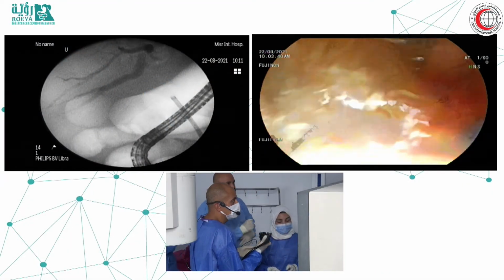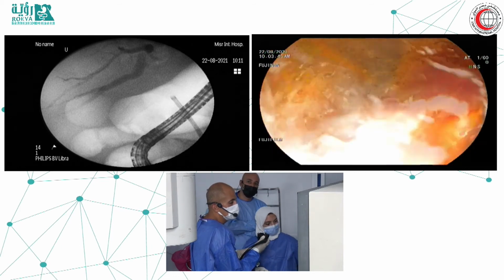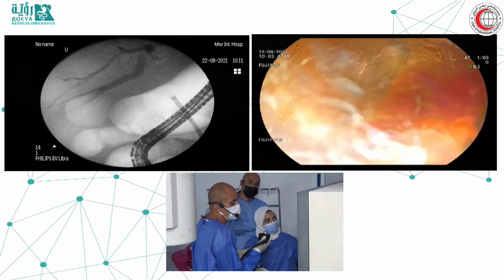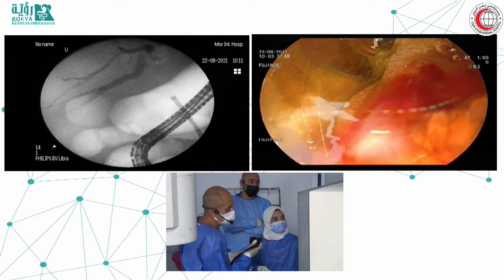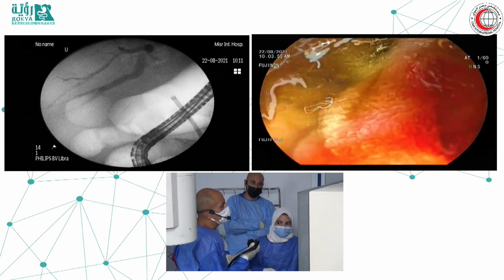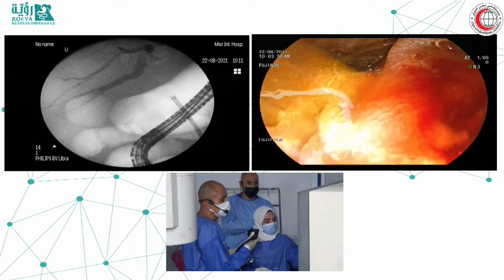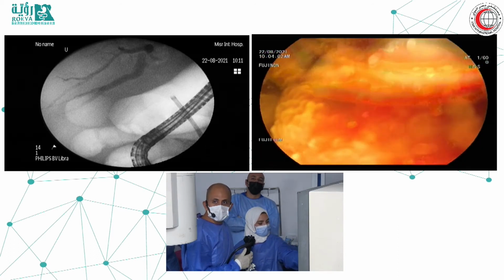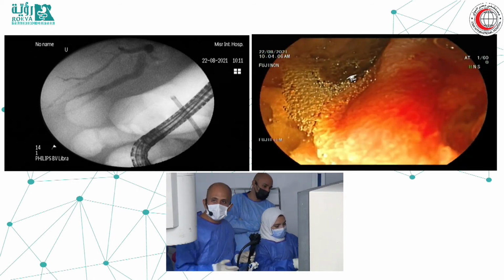Mustafa, very, very nice case, congratulations. When you see this big vessel, does it mean cancer for our audience? Does it mean that it is malignant, or do you still have some doubt in your mind? I will say this is pro malignancy. So I cannot say, as Hany said, with the gross picture only, that this is 100% malignant.